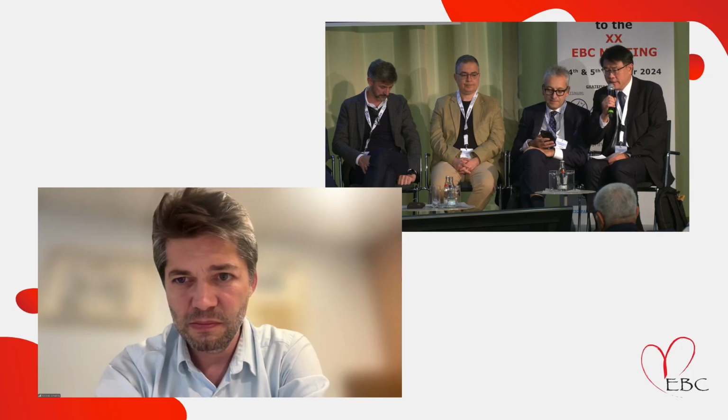Thank you for your excellent speech. Do you think there is any difference of the IVL on the bifurcation lesion and non-bifurcation lesion? Because when we use the IVL in the bifurcation lesion, sometimes the contact of the IVL balloon may not be as tight as the IVL balloon used in the non-bifurcation lesion. For example, in the left main bifurcation, if there is a discrepancy in the lumen diameter between left main and proximal LAD, which size of the IVL balloon should you choose?